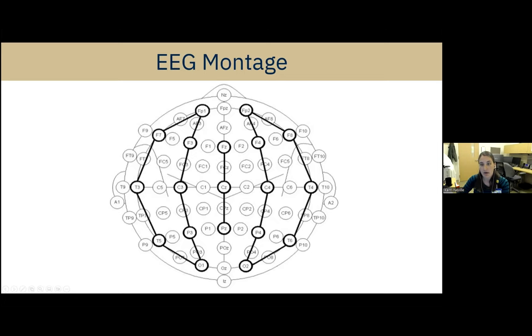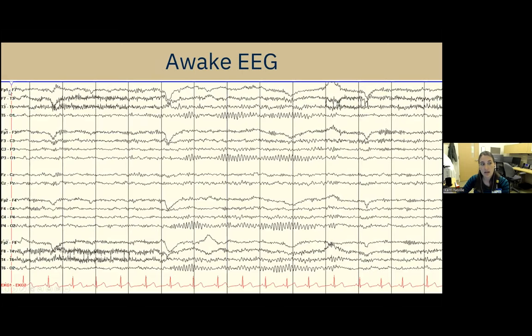The top of the screen is the left side of the brain, the bottom is the right side. The letters indicate brain regions: F for frontal, O for occipital or back. Each black vertical line is about a second, so we're looking at roughly 13 seconds of EEG on one page. This is an example of a normal awake background - what the brain waves look like when someone is just lying there awake and relaxed.